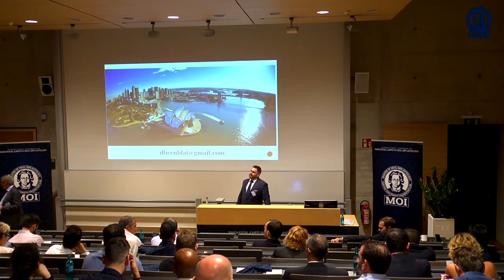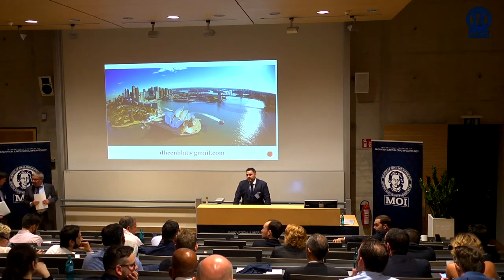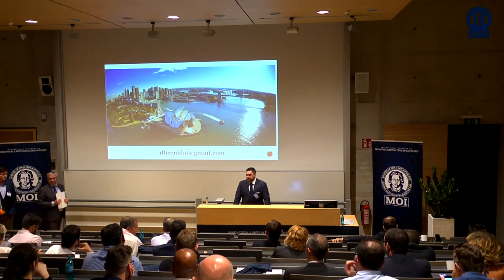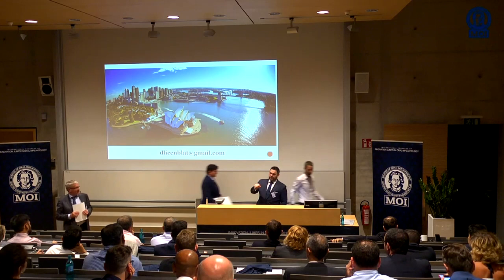We did want to do that. It had to be greater than 25, and that was because we wanted to put the standard abutment on initially.